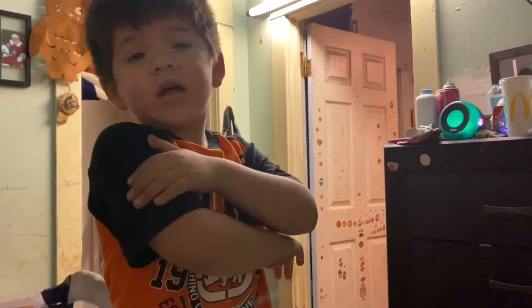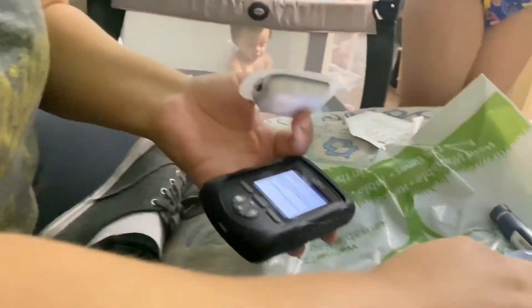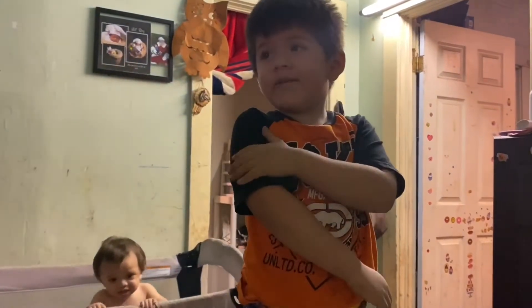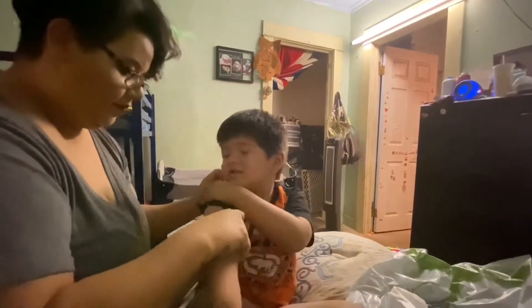Now we apply it. Do you want it on your arm or on your leg? You want it on the arm again — let's see how your arm is. His pump was right here, so I'll move it. First, clean the area with an alcohol swab and let that air dry.